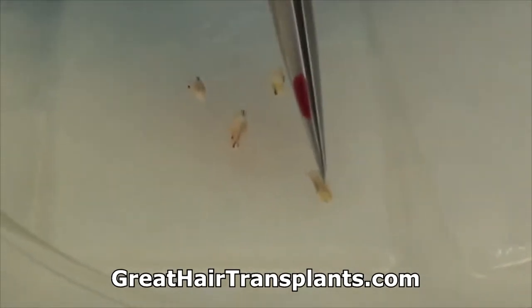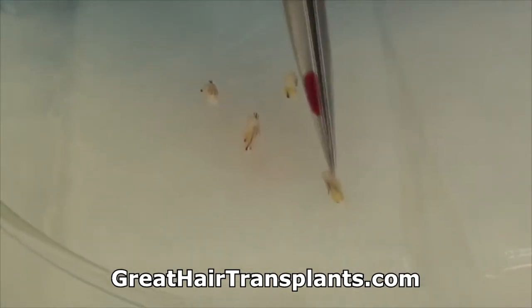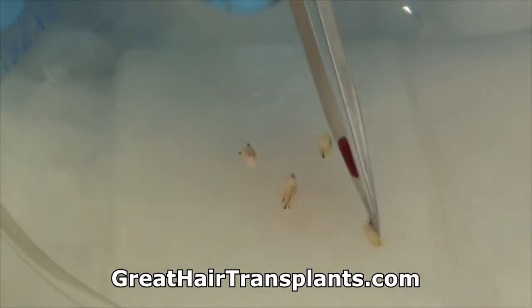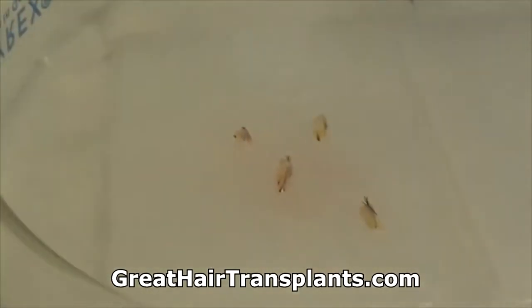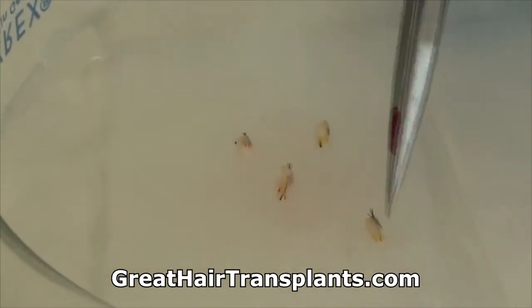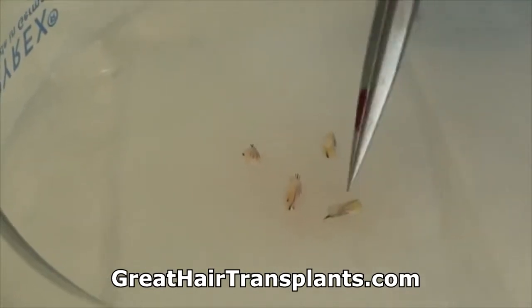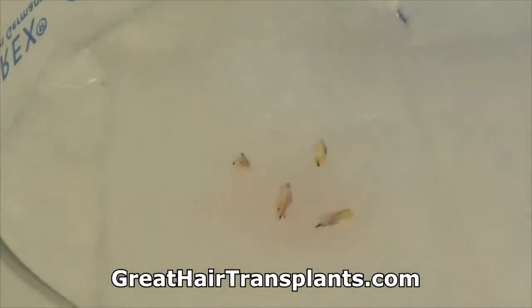Okay. Here's a 4th follicular unit we pulled out. That's transected follicle, that's transected follicle. Okay, there is a bulb in there, so we did get 1 bulb. But now look what we did. We cut this hair, we cut another hair. So we got 1 bulb and cut 3 hairs.